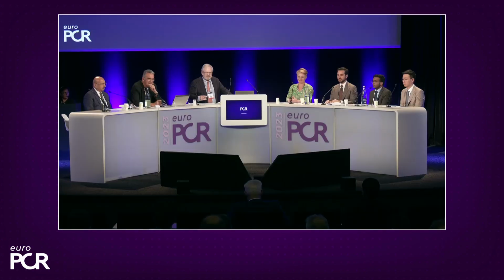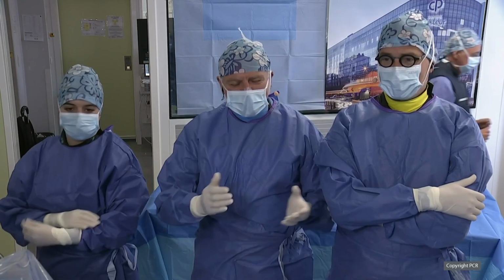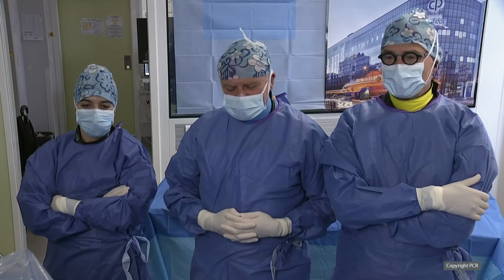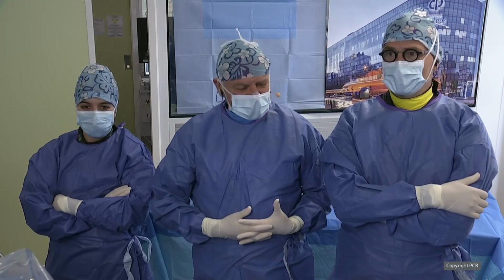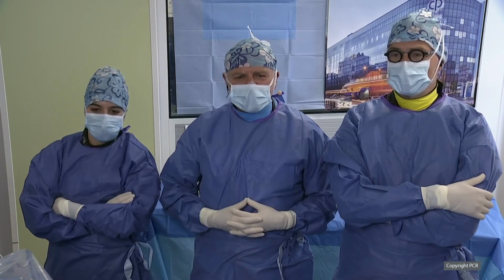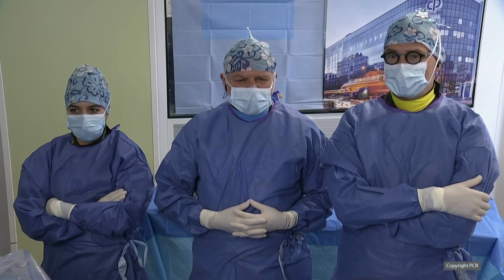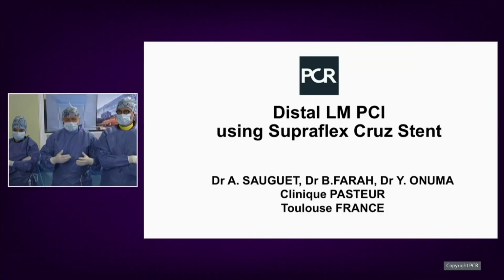We are on time. Good news. Okay, so welcome to Clinique Pasteur. All the team is ready. We have heard already all the comments made by the panel. We have not seen the MSCT image in front of us, but I have seen it before, and it's a fantastic image that you have presented. And now we can go live. So the topic of today is to perform a distal left main PCI using the Supraflex Cruz stent. We have as a guest Professor Onuma, who will be there to do the OCT at the end of the case.